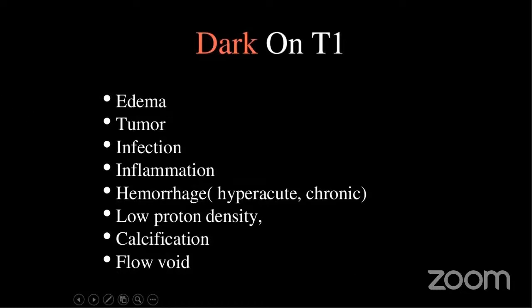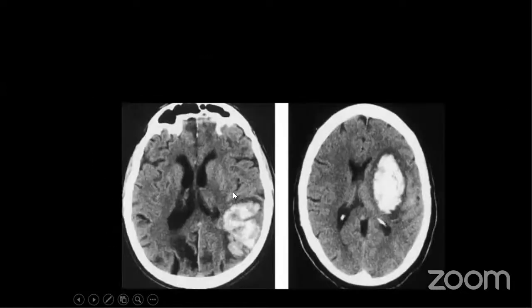Not going to give you much added information from T1, right? See, this is just a CT image I'm showing you here. But you can see something bright. By now you know there is something wrong. You just see the CT, you know something is wrong, right? So there is this huge bleed here. There's a huge intraparenchymal hemorrhage here on the left cerebral hemisphere.